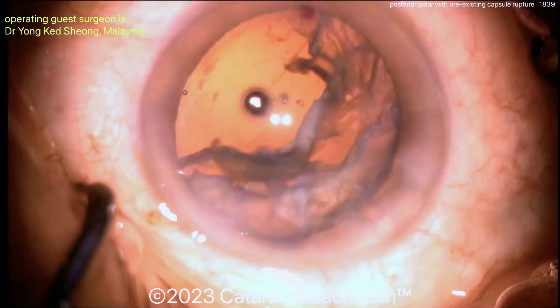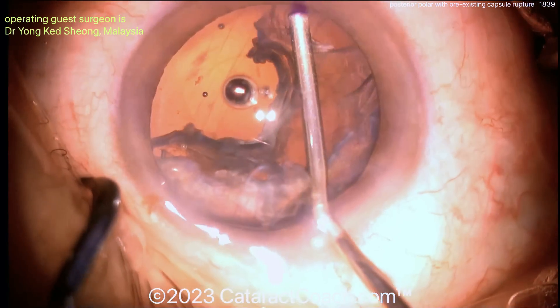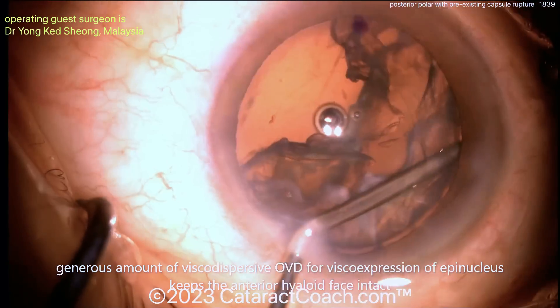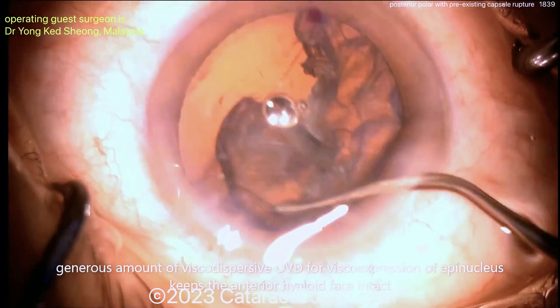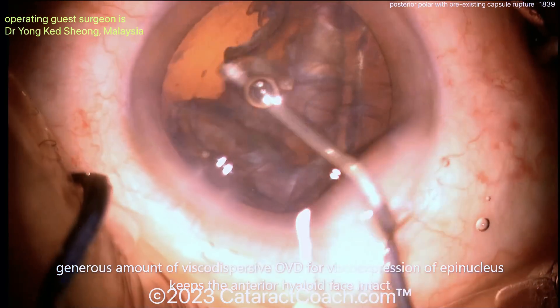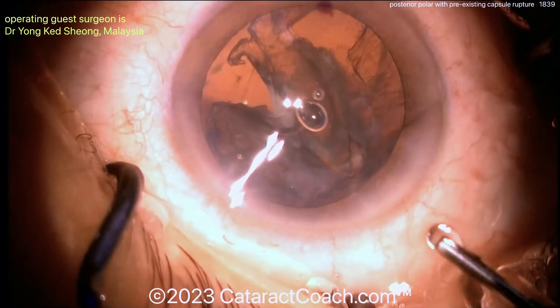Some of these posterior polar cases — I've even posted one of mine in the past, a posterior polar case where the patient had a posterior capsule defect and rupture. You can go to cataractcoach.com, click on the complete list of videos, and you will see all the videos and subcategories, including an entire category just about posterior polar. We have that many videos about it.